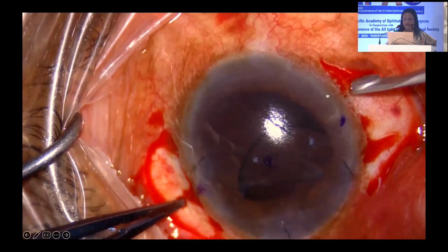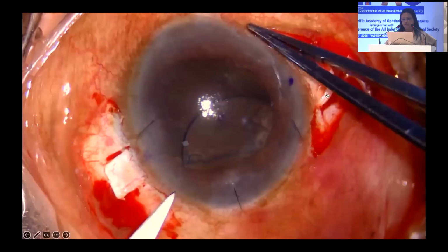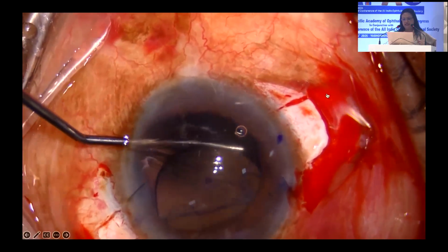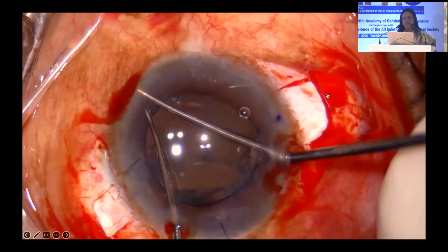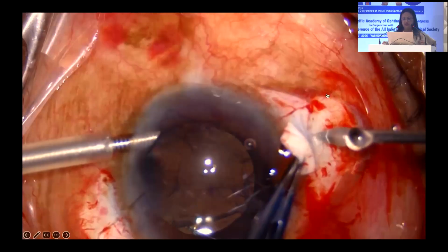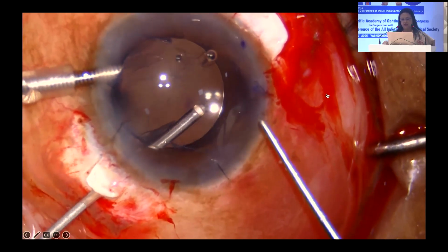So this is again a third case where the patient had the lens fixated 3 times, because there is definitely a rim of capsule all around, but every time it was fixated, I think it decentered, because either it was not placed properly, or the capsule was not strong enough, or the space was not good enough. So this time we decided that we will do a glued IOL, because the patient wanted an end to this, and he said, I have come to you because I want a complete solution to this problem.